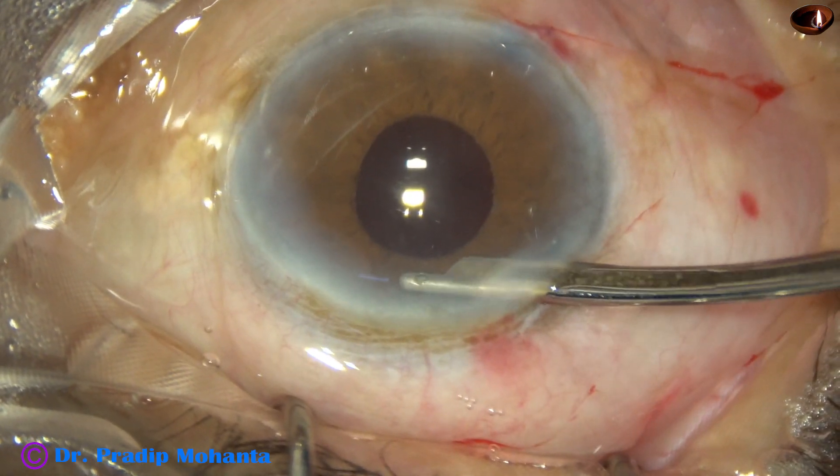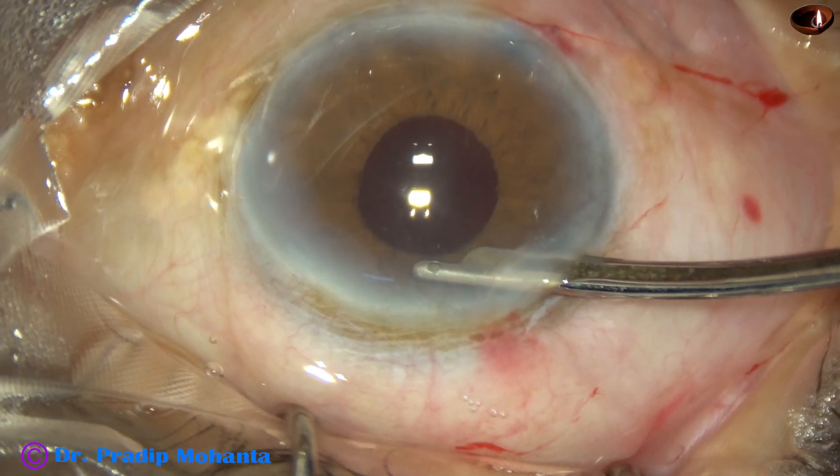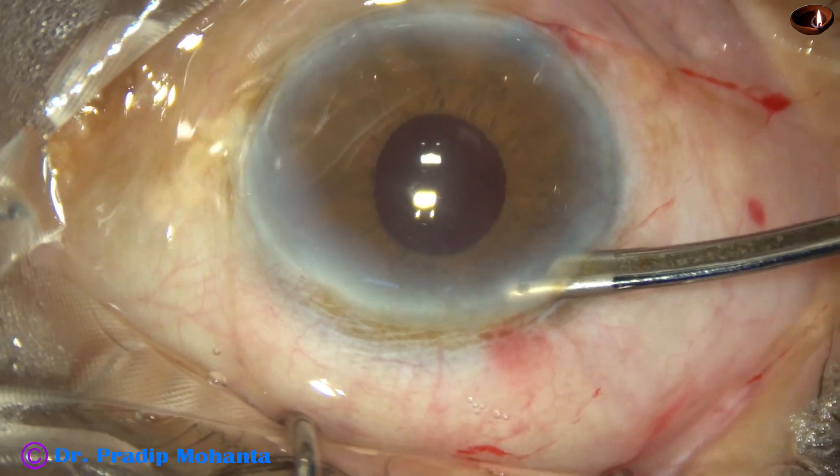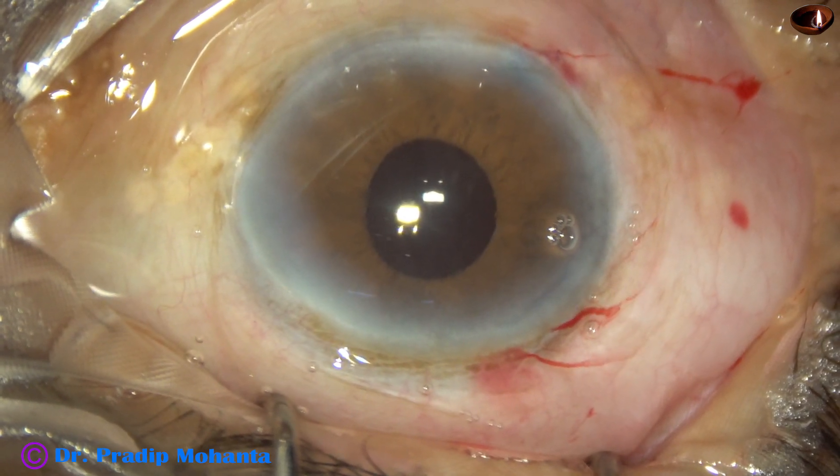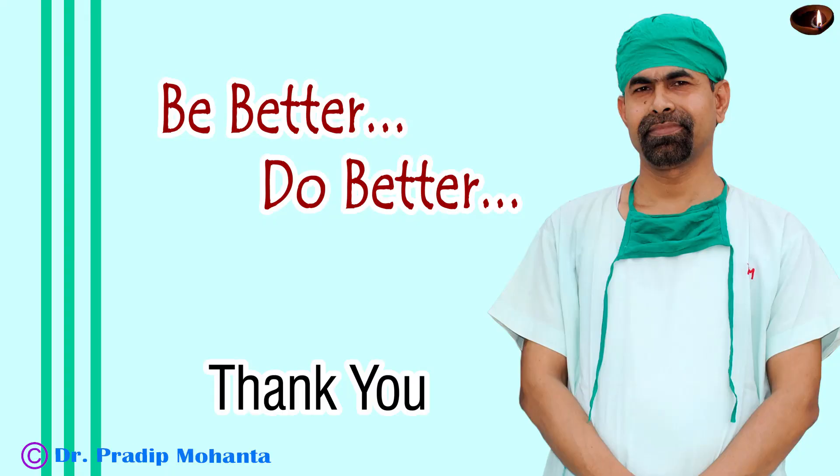So in this case, though the size of the pupil was about 3 mm — sometimes 2.5 mm — during emulsification of the nucleus, it could be managed. Thank you very much for your attention. Hope this video will help you in developing your surgical competence.